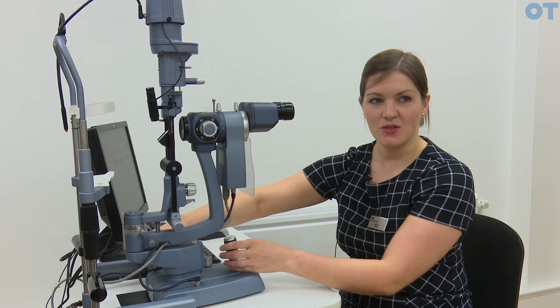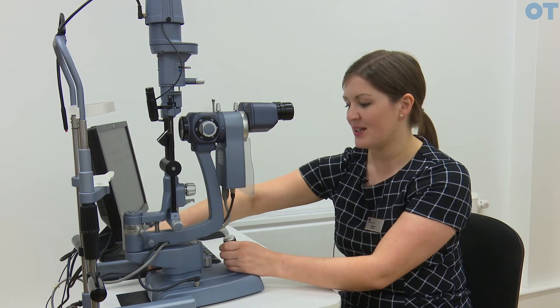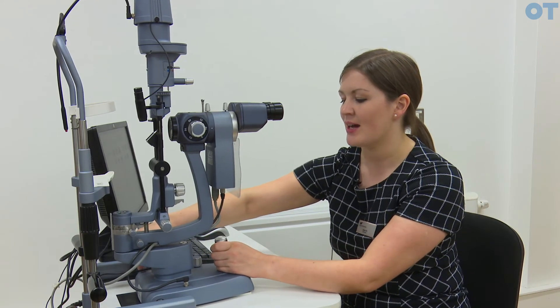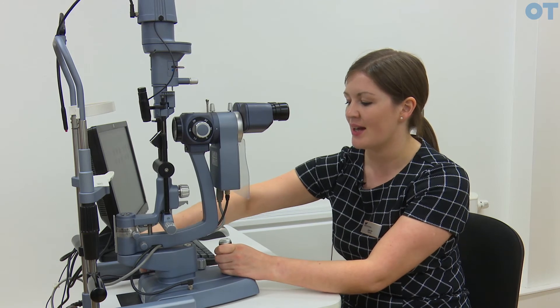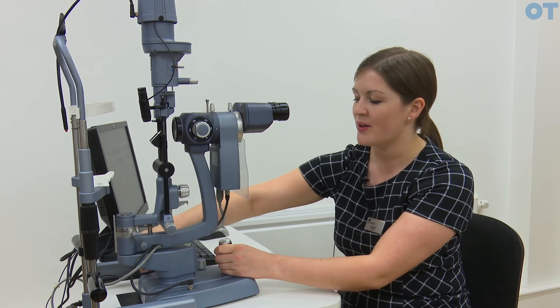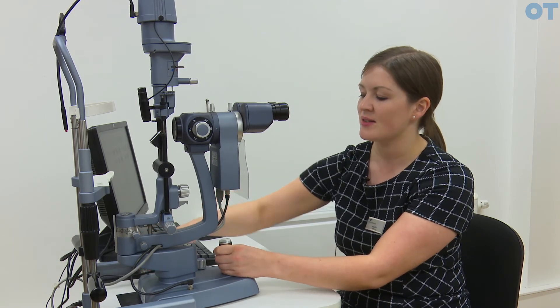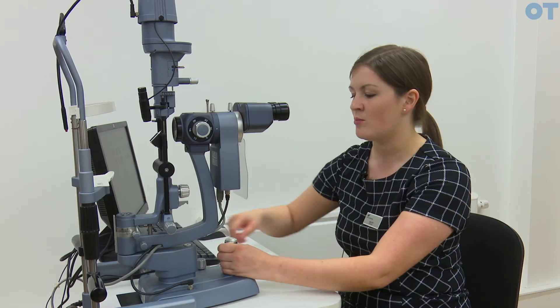This lets you lock the slit lamp in place, so if you're at the area you intend to look at and you don't want to move away, you can then lock the slit lamp so that it cannot move.